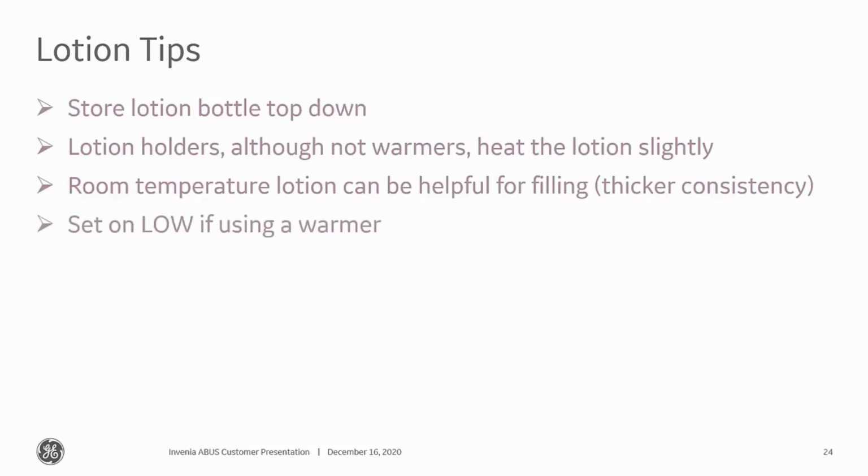If you are using a warmer, please keep it at a low warmer setting. That will ensure it from not being extremely runny. That runny lotion, as you know, is hard to control, and it really doesn't serve much of a purpose if you can't keep it in the spots that you need it. And also, a lot of times, if that lotion's been in that bottle in the warmer for a long period of time, it can start clumping up. So just keep an eye on that.